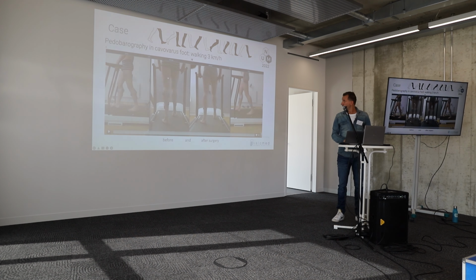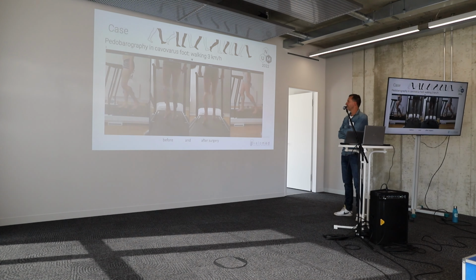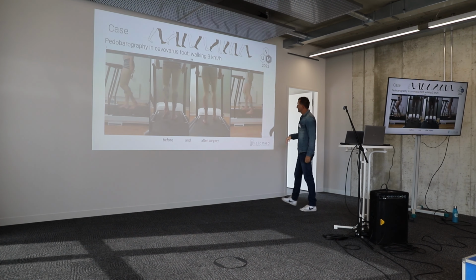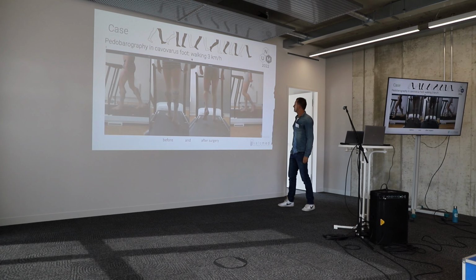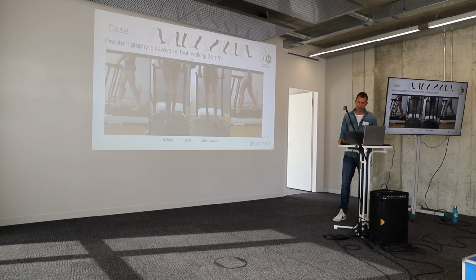So, what was the pedobarographic result after the surgery? You can see the right side, that was the operated foot. Now it's almost a hindfoot valgus, a slightly hindfoot valgus. That is 8 months after the surgery. I think the most impressive sign is from the side. You see that the toes are straight right now. And he doesn't need to contract to stabilize over the toes and the forefoot.